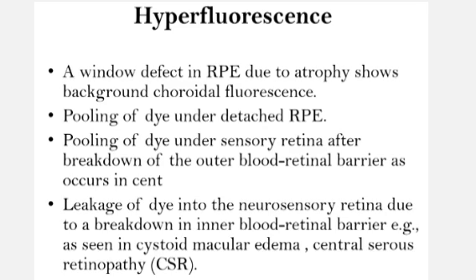Hyperfluorescence means a window defect in the RPE. A window defect in the retinal pigment epithelium due to atrophy shows background choroidal fluorescence. Pooling of dye under detached RPE.